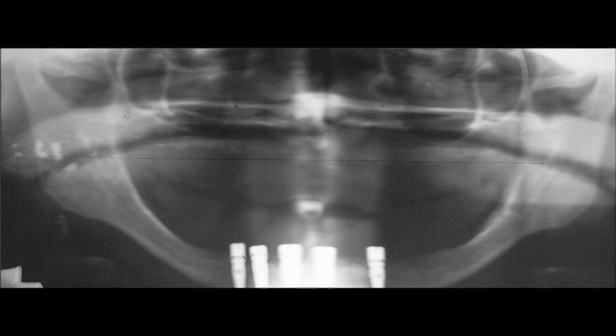But with implants in the mandible, this allows for us to do a significant service to our patient, because now we'll be able to control her vertical by having it either clip on or screw retained, and it'll help us in bringing out our patient's aesthetics by having control and not letting the patient's musculature control the bottom denture.